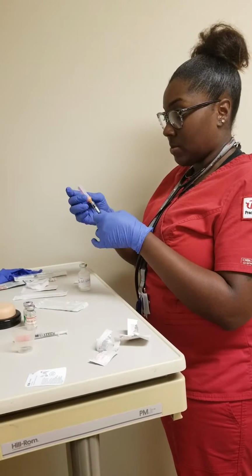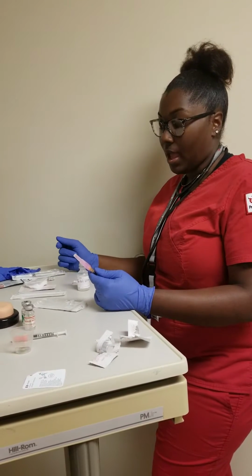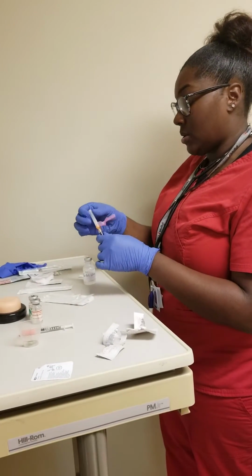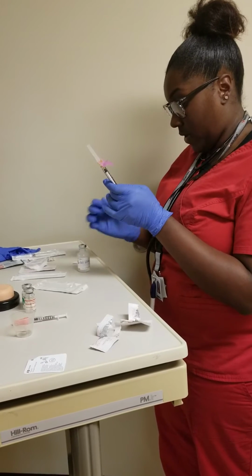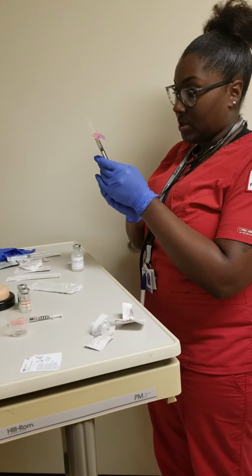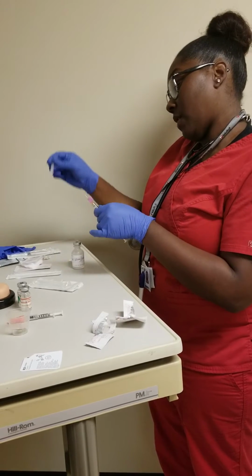My patient is a smaller patient, so I'm using a shorter needle because my patient's very thin. So I'm using my judgment to know that I don't need to get a very big needle. So I'm going to give this patient 0.5 because that's what the doctor ordered. Since this is a multi-dose vial, I will inject air first.